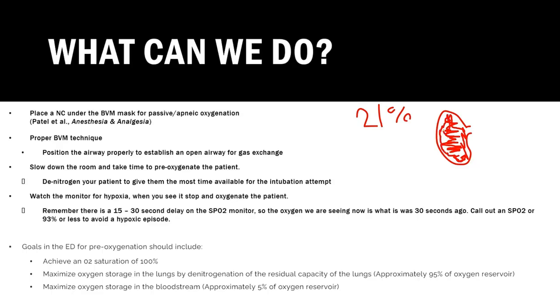That way, whenever we're not inflating and deflating this, we still have a whole bucket full of oxygen for the body to pull from. That's what denitrogenation is.